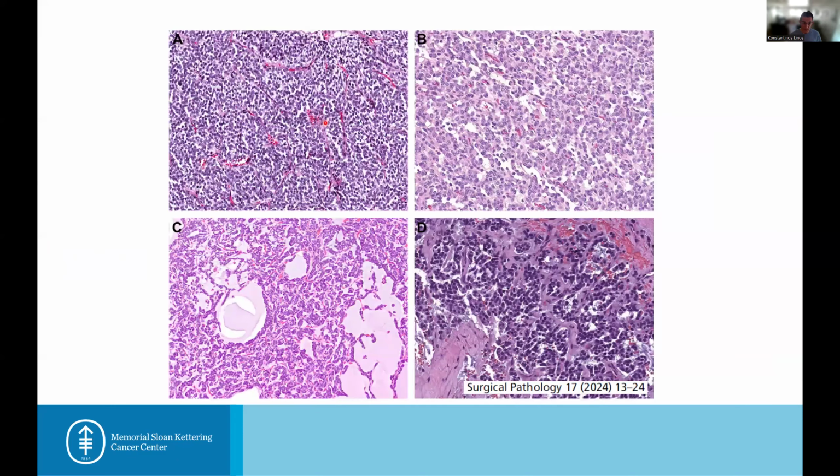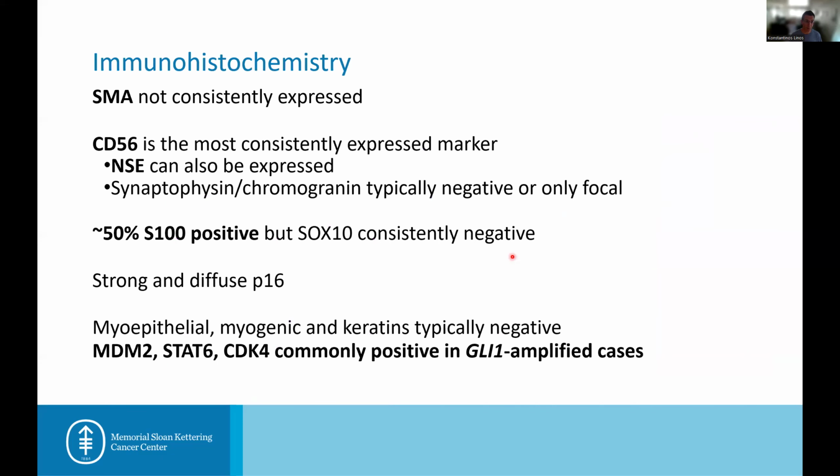The cells, for the most part, but not always, show one of the classic morphologies, although the morphologic spectrum is quite wide: uniform round epithelioid morphology resembling glomus tumor with distinct nests separated by delicate capillaries. They can also show a corded or reticular pattern, or cystic or sieve-like patterns in a myxoid background. Immunohistochemistry is not very specific.